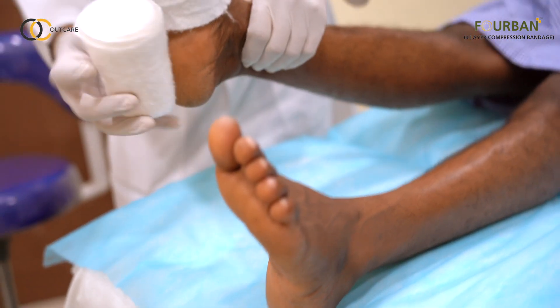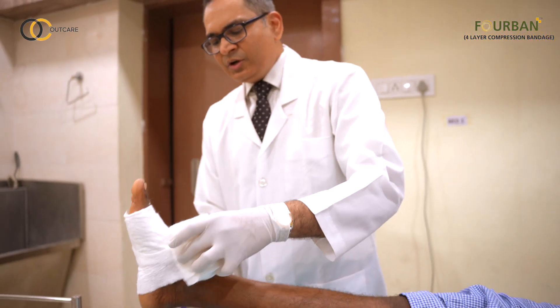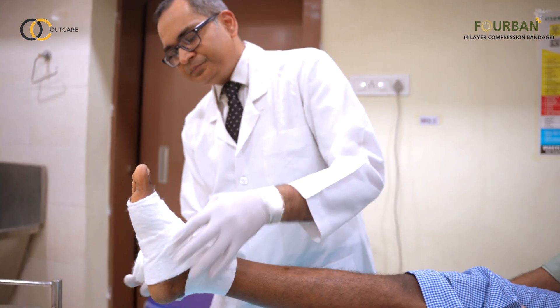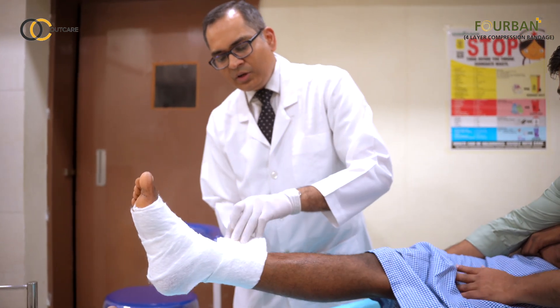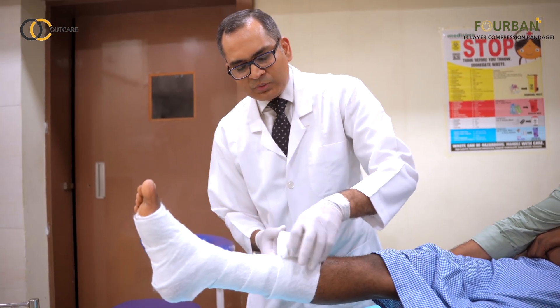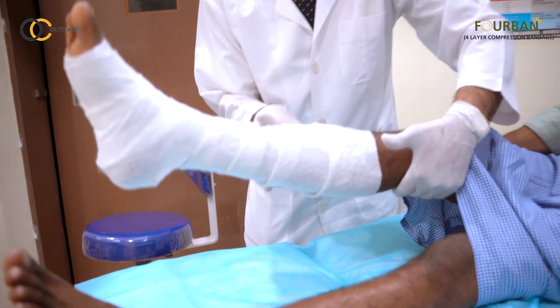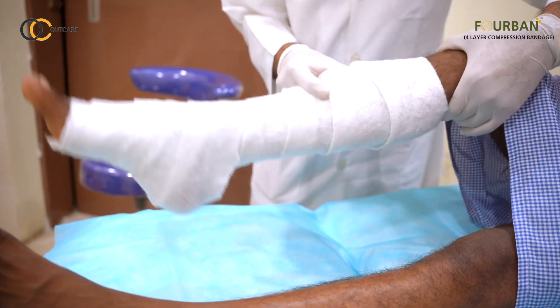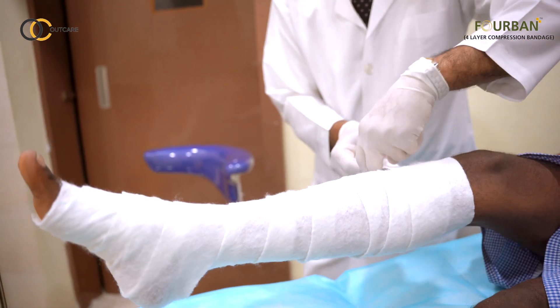We will be wrapping it around at the level of the base of the toes, going in a spiral fashion with a 50% overlap, right up to the point around 2 cm below the popliteal crease. That is 2 fingers below the knee joint. You can discard the remaining amount.